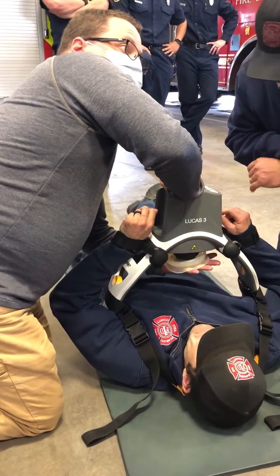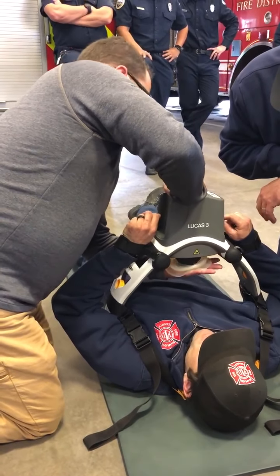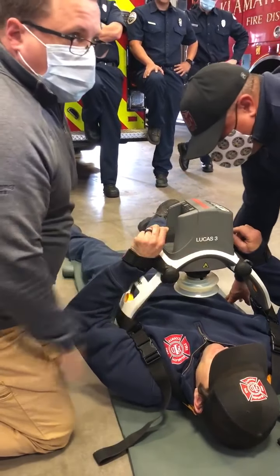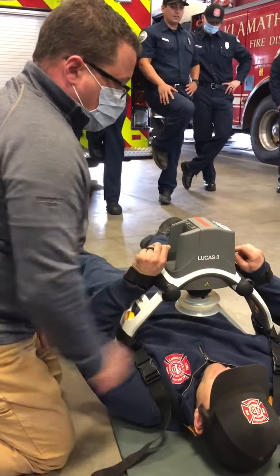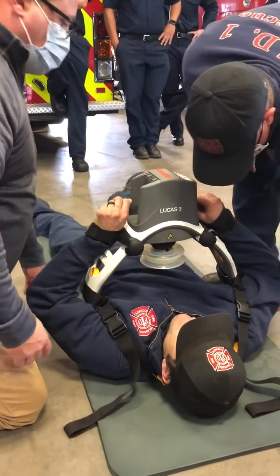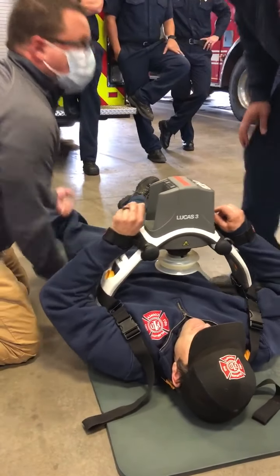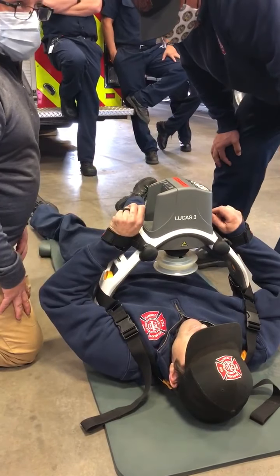So you're going to have to make sure you got it in the right spot. But even if it is all the way up there, as long as that clicked and locked in, it'll do its 2.1 inches. Now go ahead and reach under and see what that feels like if you had to log roll him. I mean, if he and I had to, we could conceivably grab a leg and the plate, lift them both to get them out of here.